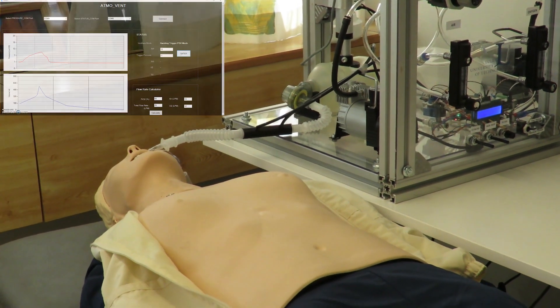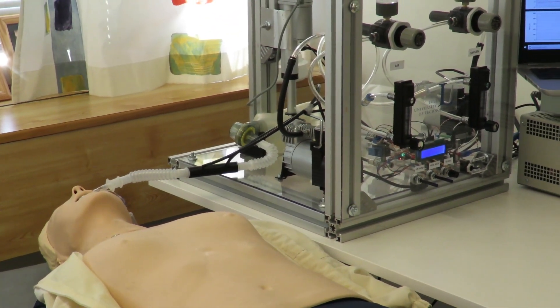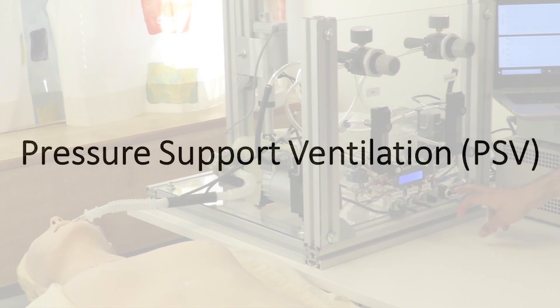In case, due to some complication in the patient's lungs, the peak inspiratory pressure is reached before supplying the set tidal volume, as a safety feature, the supply is cut off immediately and the excess pressure is safely vented out.